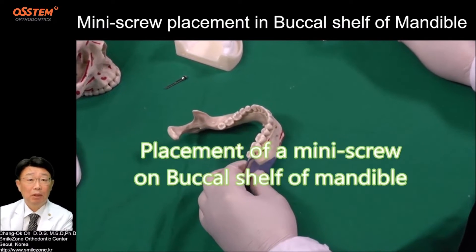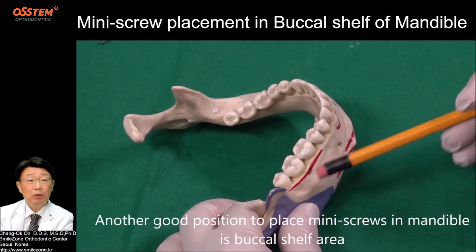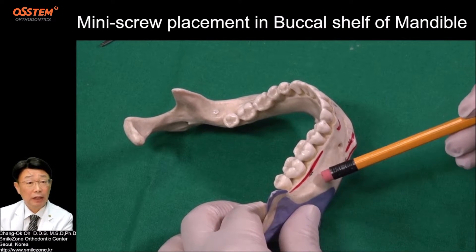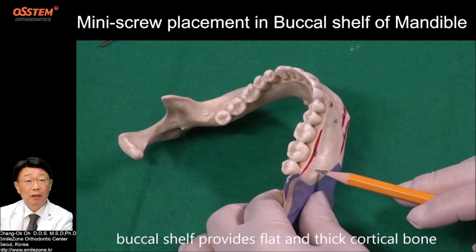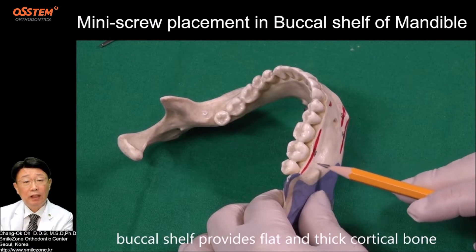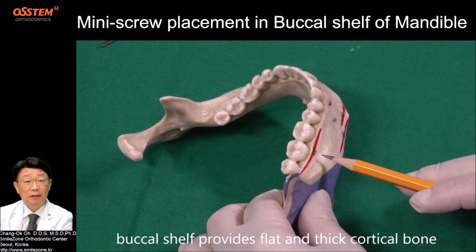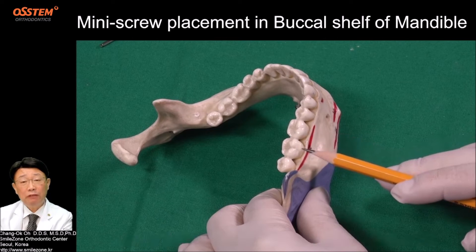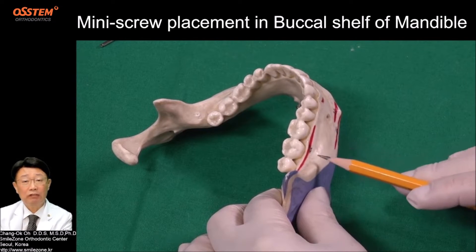Another good position to place miniscrews in the mandible is the Buccal Shelf area. This is the Buccal Shelf. It provides flat and thick cortical bone. Usually, the shelf starts between the first and second molar, but a lot of individual variations exist.